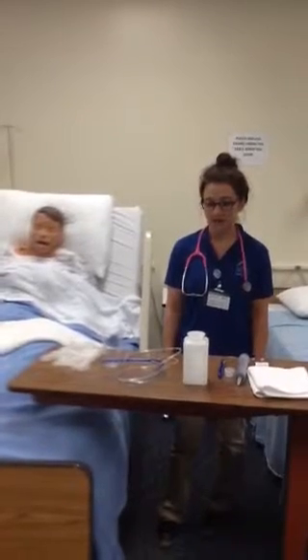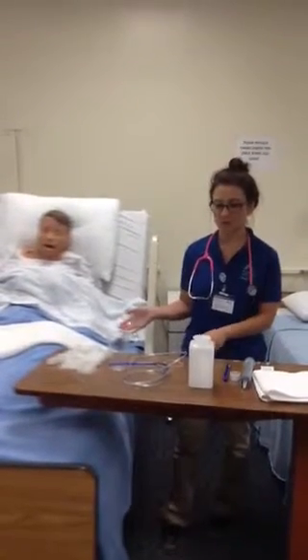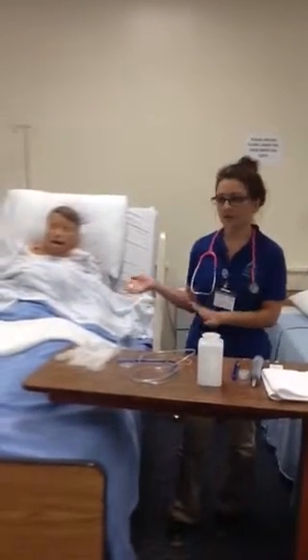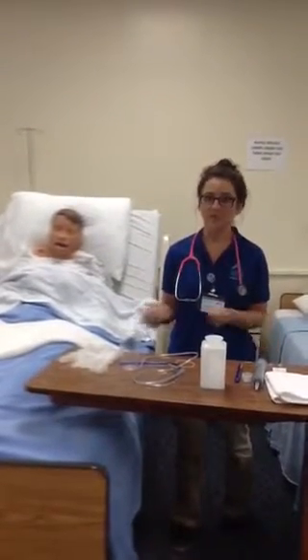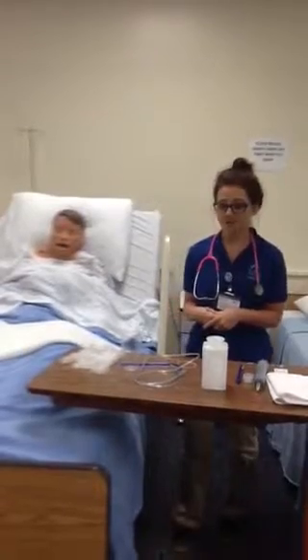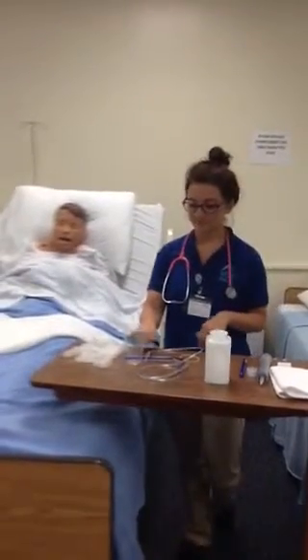Before beginning, I would make sure, coming into the patient's room, that the bed is in a high Fowler's position and it's up to my waist level for easy working with the patient. So now I'm going to go into the patient's room.